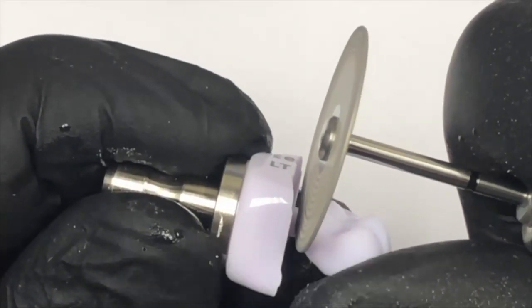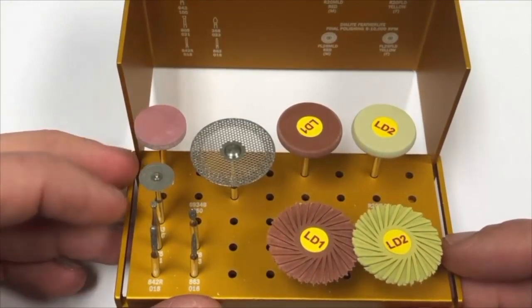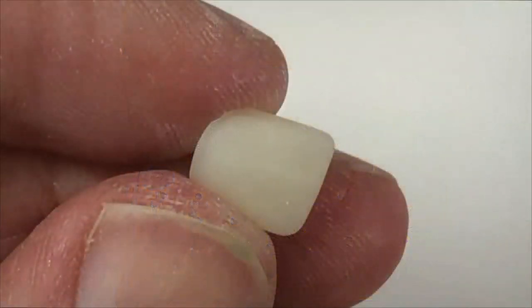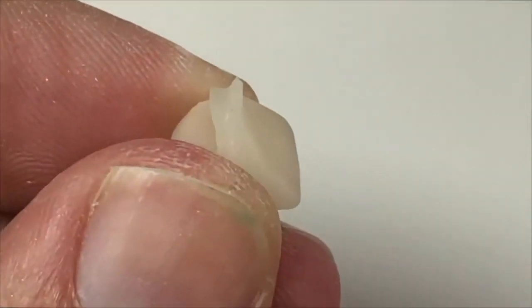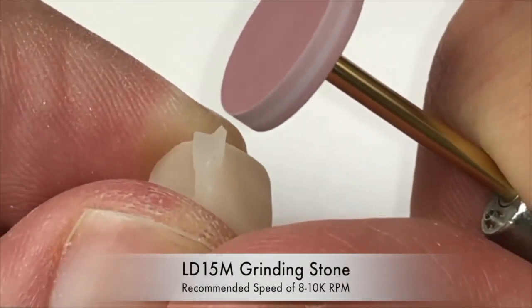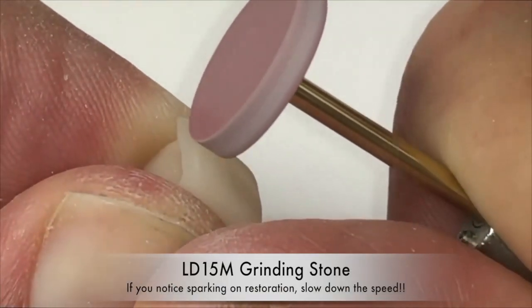A helpful hint is to stop short of going all the way through the sprue and gently break it off with your fingers. When finishing the sprue, the LD15M grinding stone is used. The epoxy bonded diamond stone keeps heat below 275 degrees Fahrenheit to prevent chipping and microfracturing caused by excessive heat generation. Here you see the sprue being gently removed from the lingual of this restoration with the grinding stone. You must proceed very slowly to prevent microfracturing of the restoration.